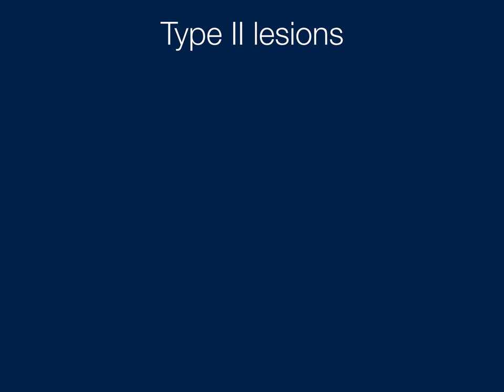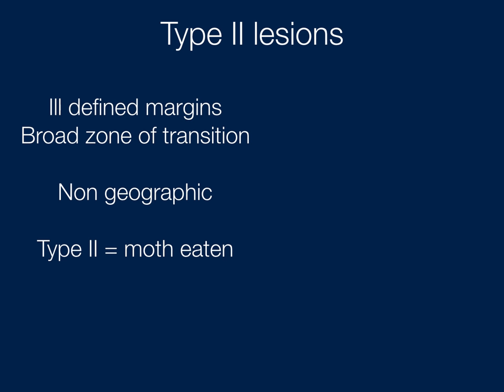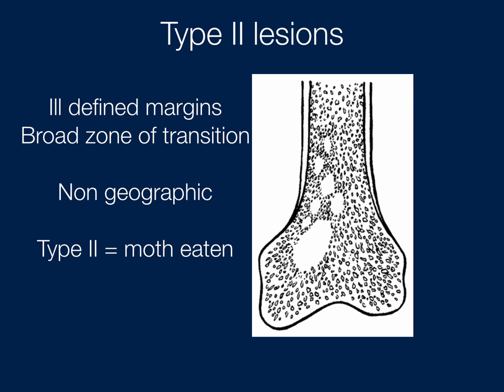Moving on to type 2 lesions — again, the classifications are not as important as the patterns. This type has ill-defined margins and a broad zone of transition; it's not a geographic lesion. Type 2 is the moth-eaten pattern. Here's an example with several small lucencies, likely some of which are ill-defined.